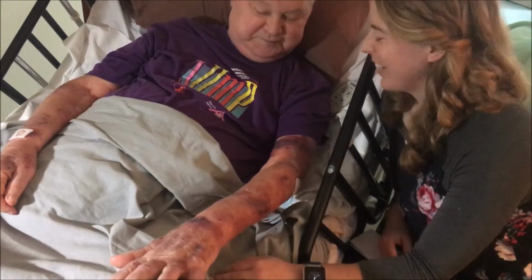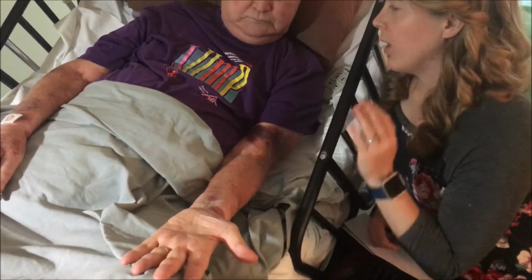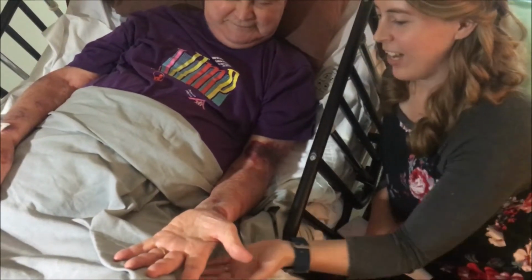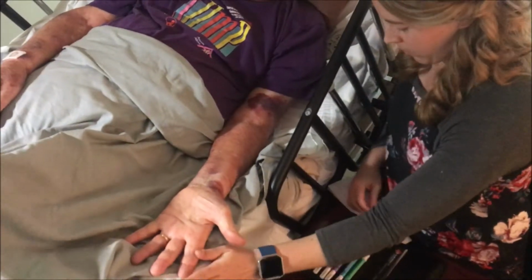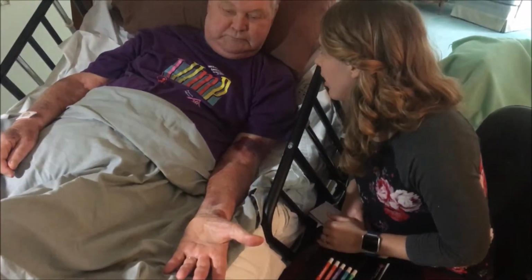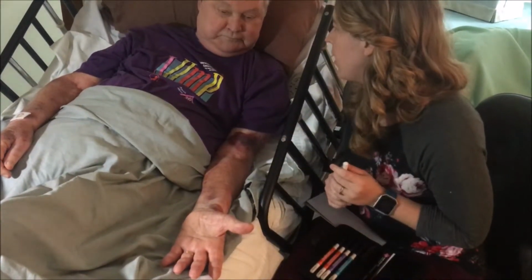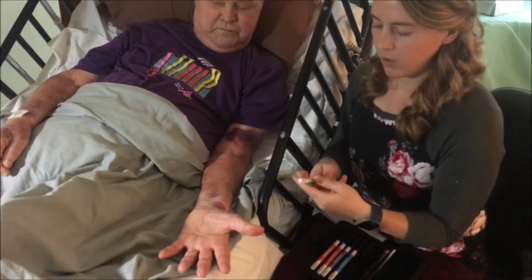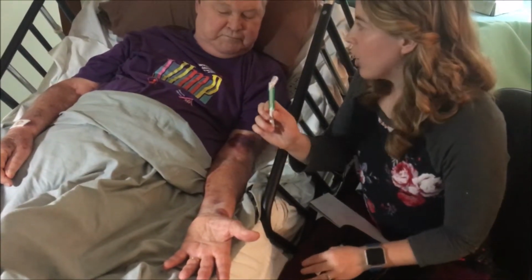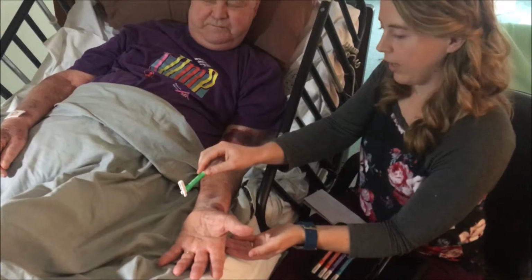So for this assessment, what I'm going to have you do is flip your hand over so it's palm up. We're going to make sure that the environment's quiet. I'll have you rest your hand on the bed so you're nice and comfortable. I'll make sure that your eyes are closed during this assessment, and whenever you feel me touch your hand with my little tool here, you're just going to say touch. I'm going to start off with the lightest touch pressure. There could be a long pause, so don't worry if you don't feel anything right away.